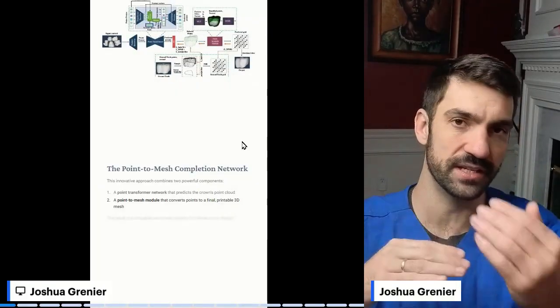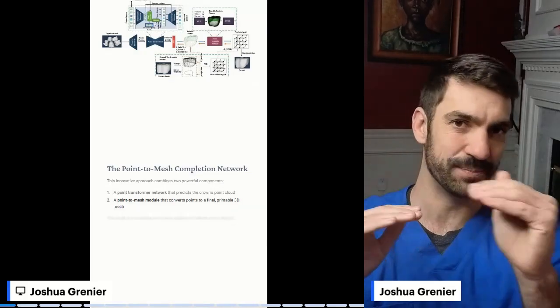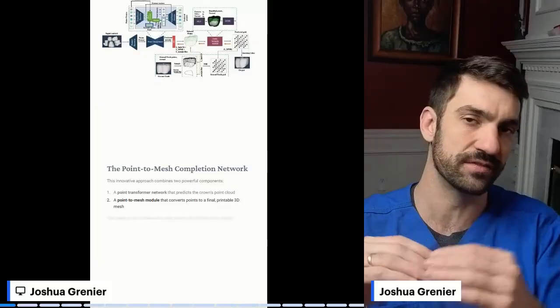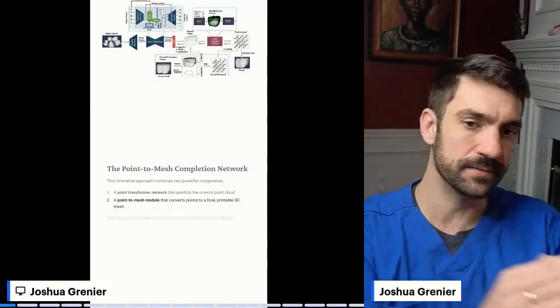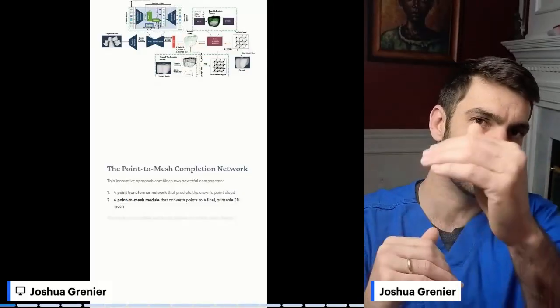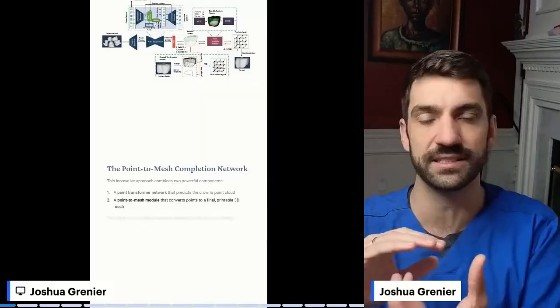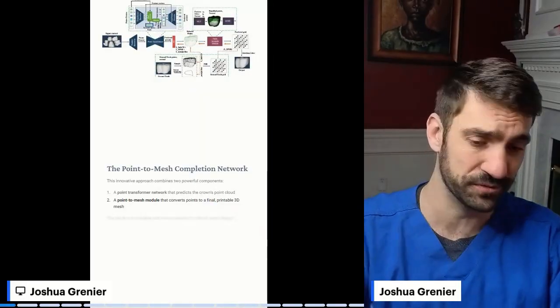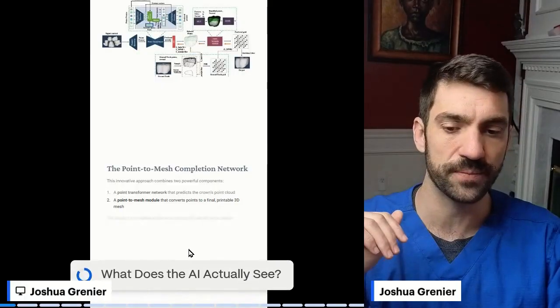for this, which is then used to generate a crown. Like ChatGPT generates the next piece of text based on what it's already seen. This is essentially what it's doing, where instead of spitting out text, it's spitting out points on a point cloud. And then there's additional testing where it's able to retake that point cloud, or many different ones at the same time, gradually improving until you have a mesh at the very end. And that's an incredibly high level, very simplified, and probably fairly inaccurate way of how these systems actually work.